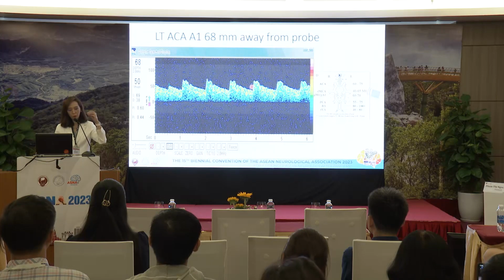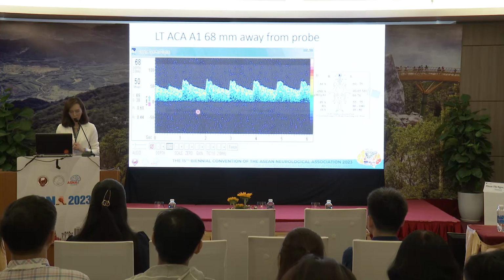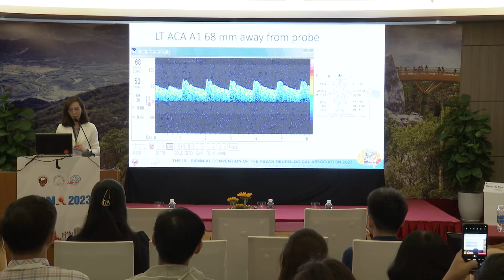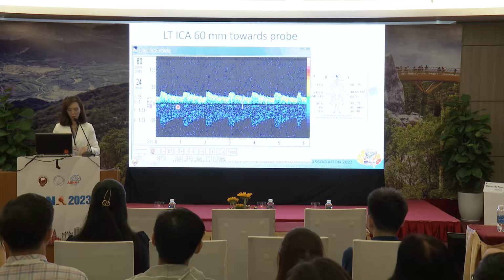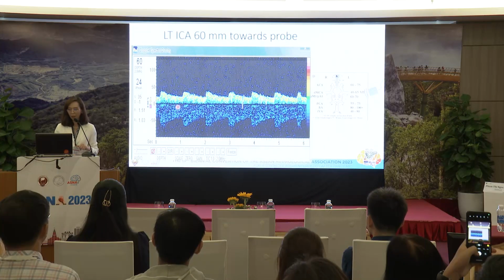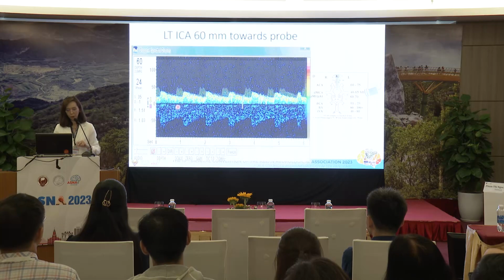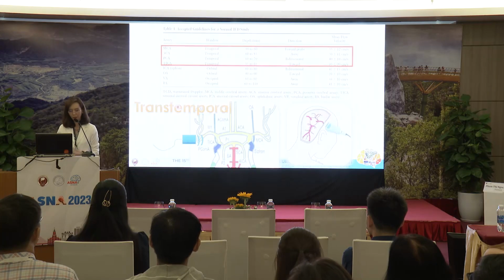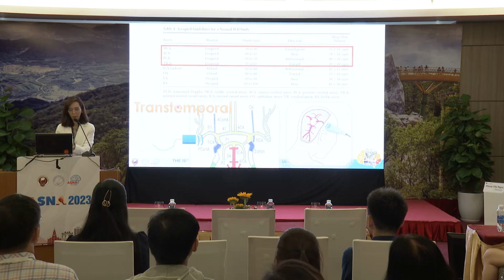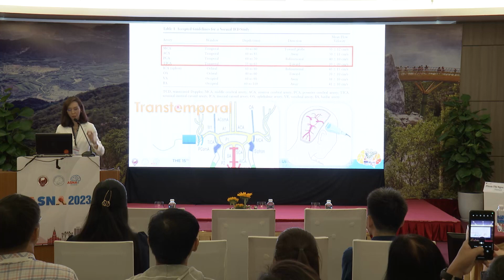And if you go deeper, you get ACA and MCA together. And then you move the probe, kind of tilt the probe a little bit to the front. You'll find the ACA, which is going away from the probe. You can see that this is above the line, but the signal over here shows that it's going away from the probe. It's a little confusing, but you'll do it during the hands-on. And then ICA, a little bit downward. PCA also from the temporal approach, tilting to the back, you'll find the PCA. So transtemporal, you'll find different arteries. I think this is the most important part for the anterior circulation.